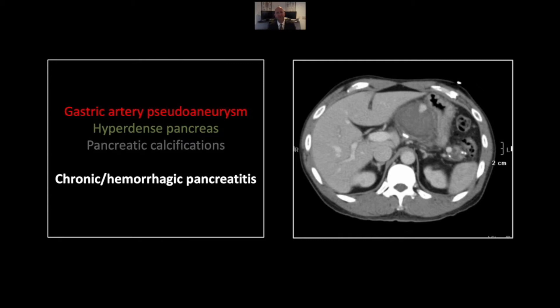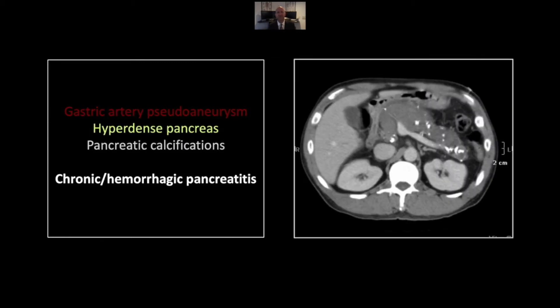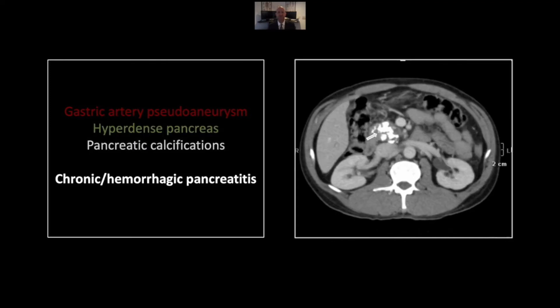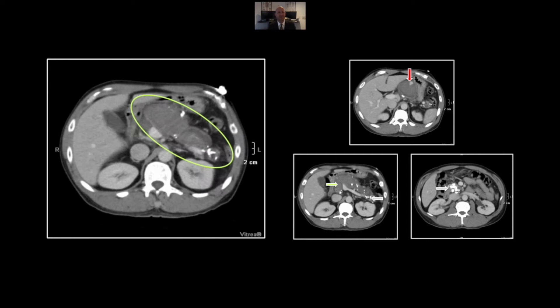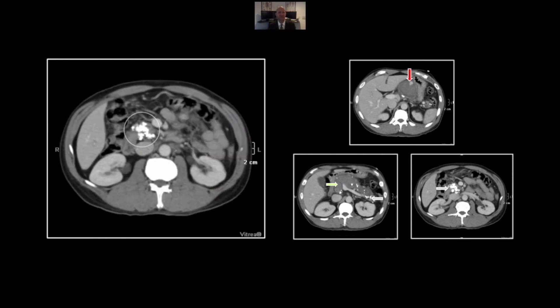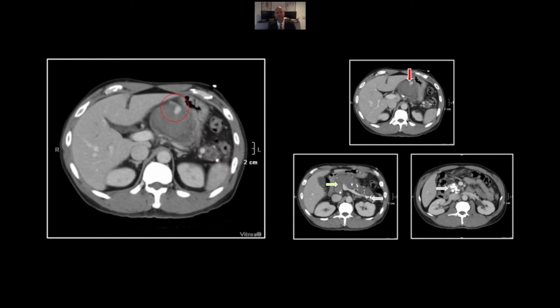Our next case is also hemorrhagic pancreatitis, but this is an acute hemorrhagic event superimposed on chronic pancreatitis. You can see a small collection of contrast within a larger hyperdense fluid collection — that's the origin of this hemorrhage, most likely from the left gastric artery. Lower down, you can appreciate hyperdense fluid within the pancreatic parenchyma as well as extensive pancreatic calcifications, very densely packed in the pancreatic head. On the cine, you can appreciate the small pseudoaneurysm, again probably from the left gastric artery, the extensive hyperdense fluid collection, and the dense calcifications representing chronic pancreatitis.